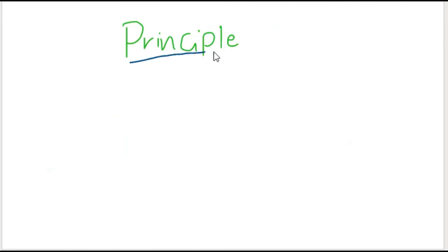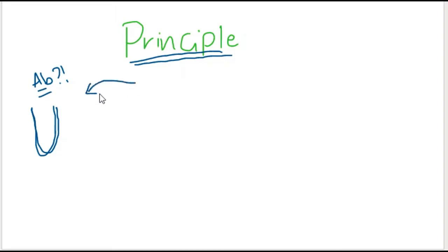The main aim of this test is to detect antibody. Because we want to know if a patient or donor has antibody, we will take the serum of the donor or the patient. So the antibody is unknown, and we want to know if she or he has it or not. So if the antibody is unknown, we have to add a reagent which is able to detect the presence of this unknown protein. So here in this case, we have to add antigen that we know the specificity of.